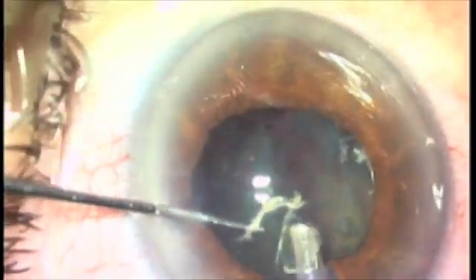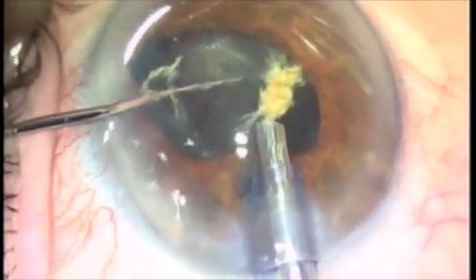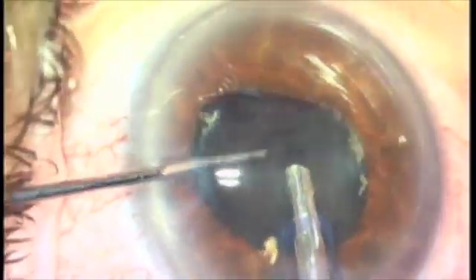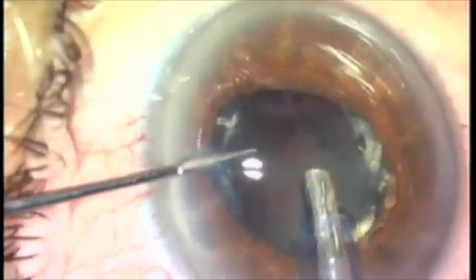It's ideal. If you want more breathing space, squirt some more viscoelastic behind the nucleus and raise it up, and use the nucleus as the pupil expander. As you can see, I'm beautifully manipulating this nucleus right into the center of my pupil and managing it in that way.